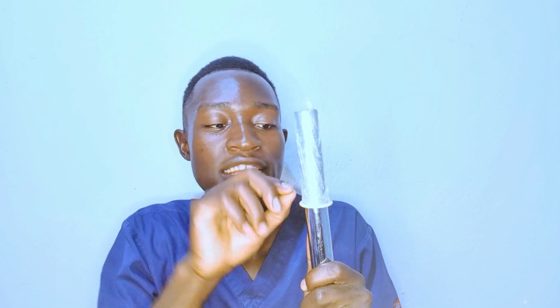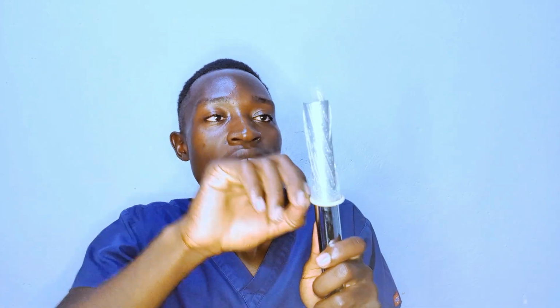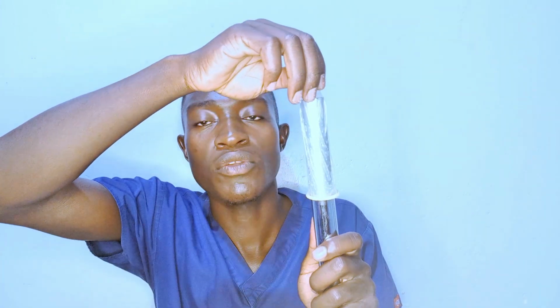After you have had sex and after ejaculation, that is when you go on to remove the condom. While removing the condom, first of all, you need to hold the base of the condom. I don't have somebody who can hold this for me. So you hold here and you support here with your other hand.